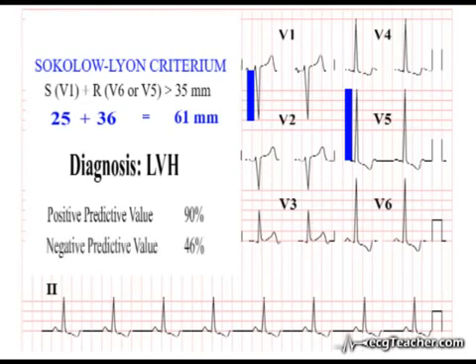This pattern is observed with all voltage criteria, and probably reflects the fact that factors other than muscle mass influence the amplitude of deflections in the leads. For example, in obese individuals, the increased distance of the leads from the heart tends to dampen down the amplitude of the deflections produced. Basically, if the voltage criteria are present on the ECG, this is strong evidence of underlying LVH. However, if they are not, this does not reliably rule out hypertrophy.